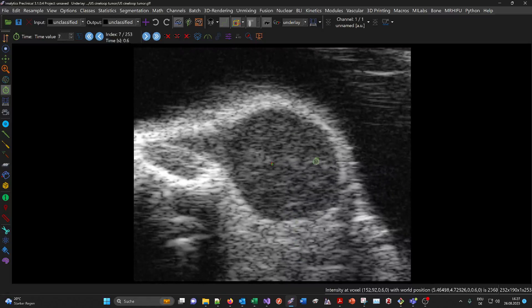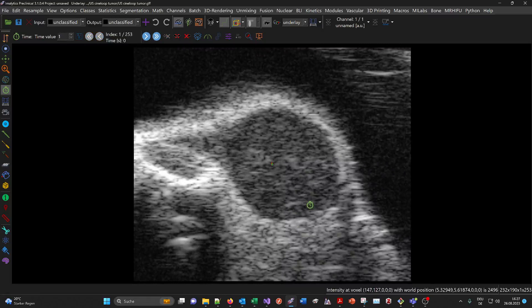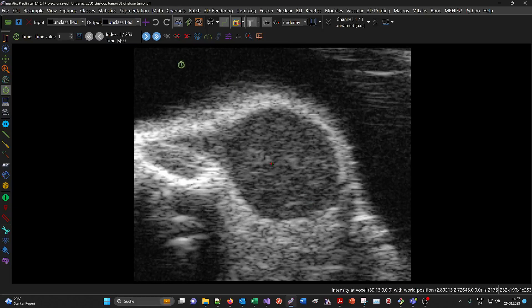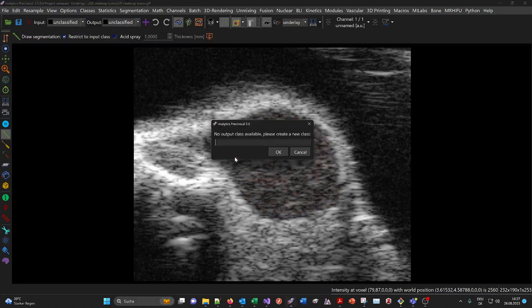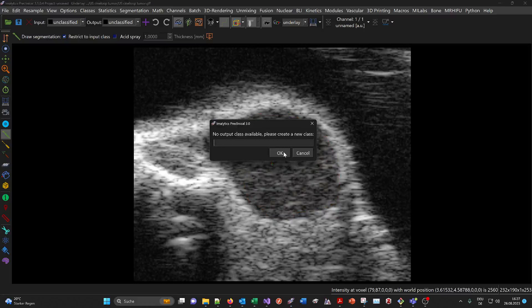This dataset was acquired with the Visual Sonics Vivo system. Now you can use the draw segmentation mouse mode to delineate the tumor here, then enter a class name 'tumor'.